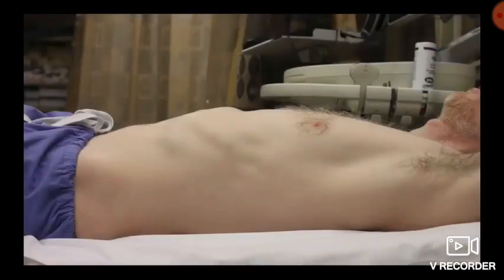As far as where to place the probe on the abdomen, the most anterior part of the abdomen, on this patient about right there, would probably be the first place that I'll look, but you can look all over. Some people actually talk about placing the patient in the left lateral decubitus to look right above the liver. I find that that is a little cumbersome sometimes, and so I just have them lay on their backs, or however it is that they are when I see them, and scan just the most anterior part of their abdominal cavity.